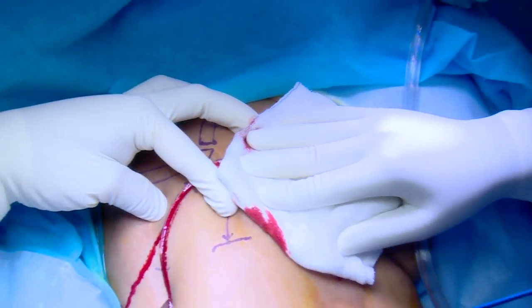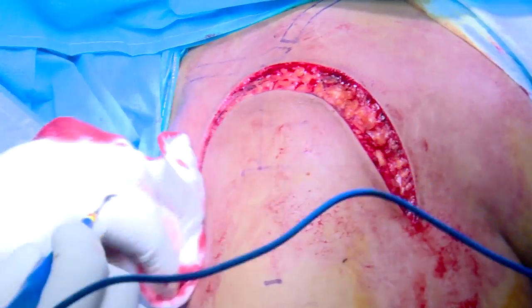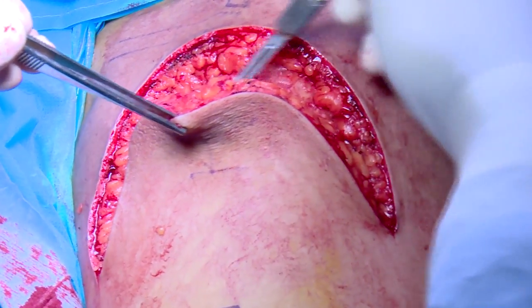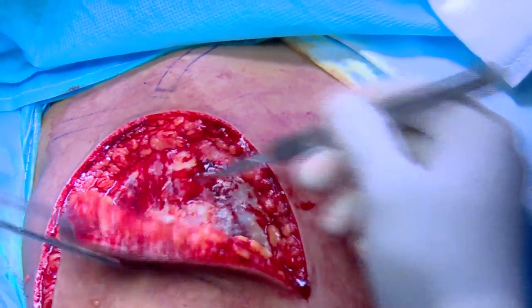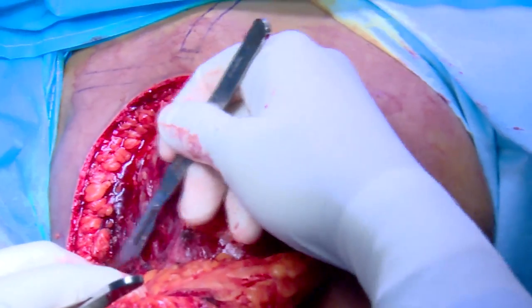Full thickness skin flaps are raised without undermining the flap. Bleeding vessels should be cauterized. Further bleeding from the flap can be minimized by infiltrating the skin with local anaesthetic mixed with epinephrine prior to the skin incision. The skin flap is raised distally to the predetermined length to allow safe fracture reduction and plate fixation. The approach provides excellent lateral access to the shoulder due to easier deltoid retraction, since the skin is completely moved out of the way.